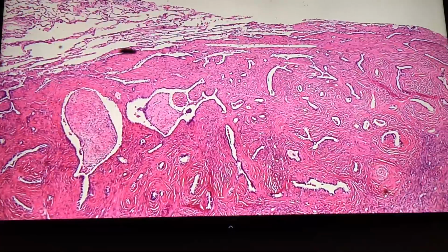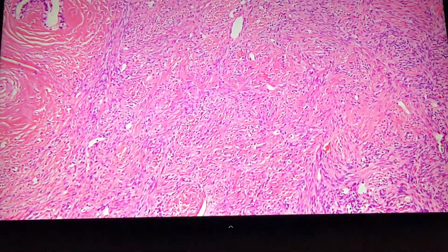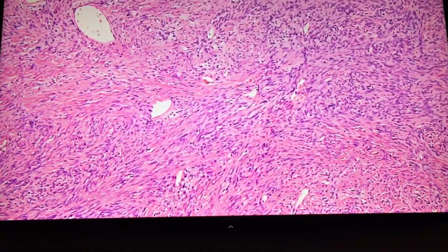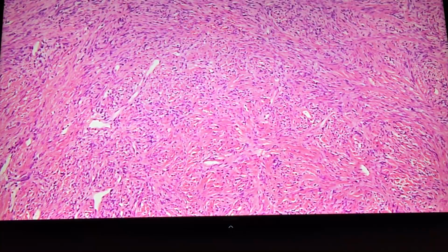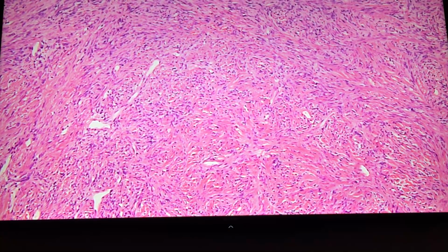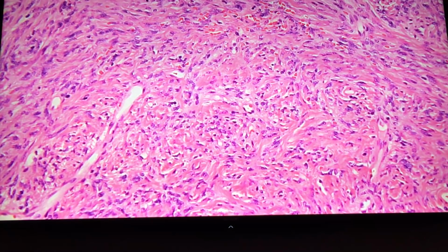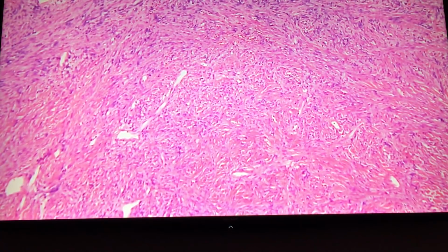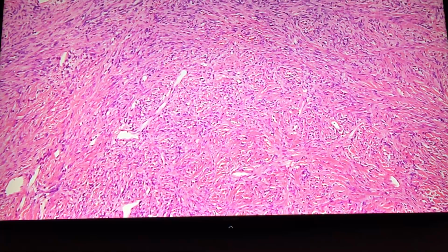We're in lung. It's a little bit out of focus, Aaron. You can leave it there, just get it into focus a little. And one higher mag. Just leave it there for a couple of seconds so everybody can see what's going on. Now get it back to low mag again. I kind of like that sequence. You start at low mag, then you go to high mag and get your sense, then come back to low mag again and reassess the relationship.